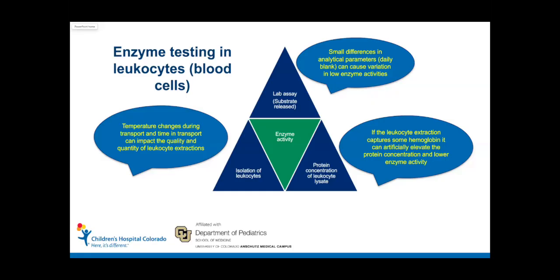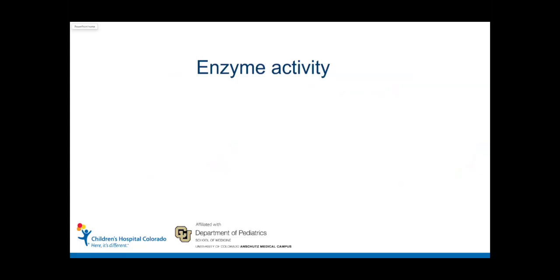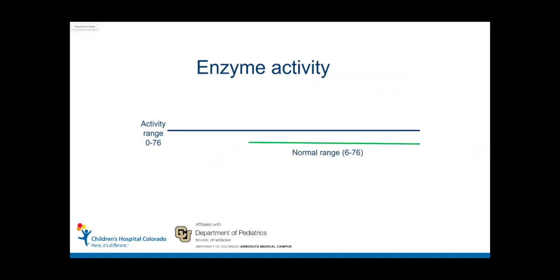So these are just some of the things to keep in mind when you're trying to do comparisons of enzyme activities. If we back up a little bit and we now have our enzyme activity, let's talk about the broader context of how this works on a population scale. Let's say we have an enzyme that has an activity somewhere between 0 and around 80, and we have this normal range that, if you were to pull a blood sample from anybody walking on the street, would typically be between 6 and 76.